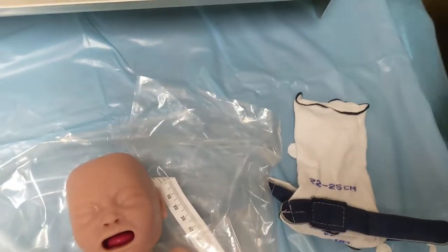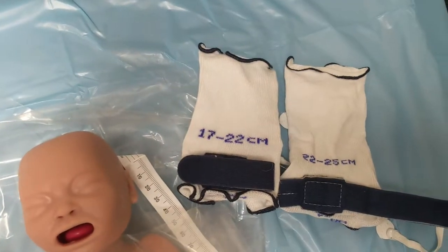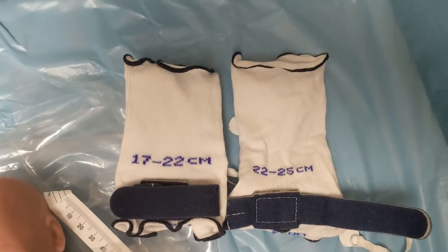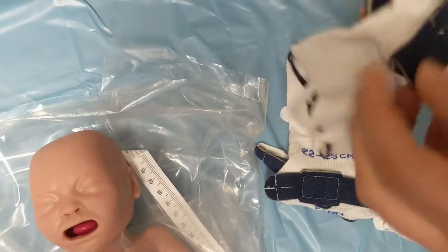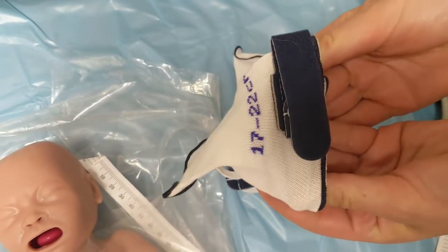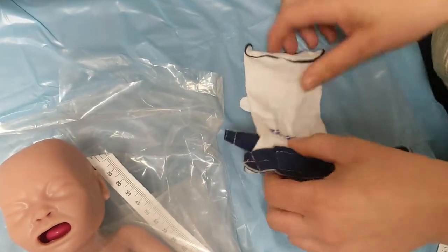But if we were at 22, which of these hats would we use? The smaller one! Because we want our hats to be as snug as possible. But since we're 23, we'll go with this one.